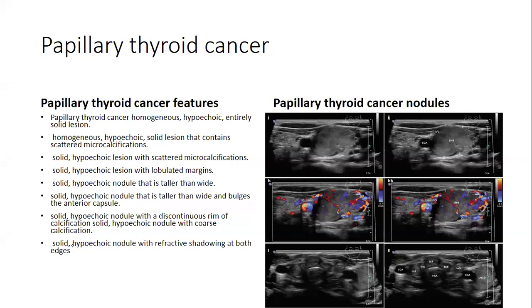Then you could also, when you interrogate this on color Doppler, see that there is intranodular perfusion.